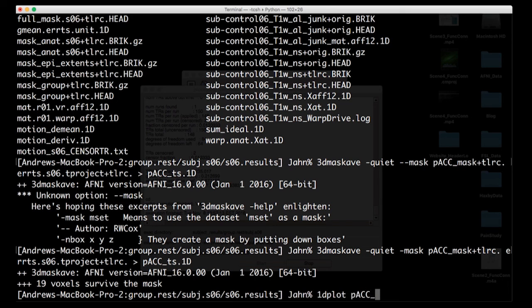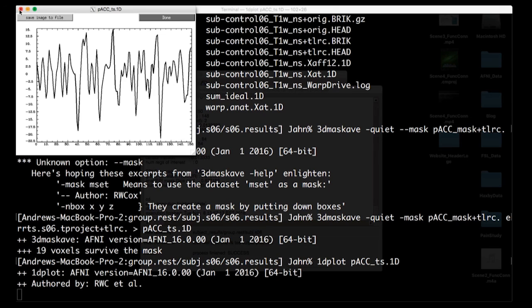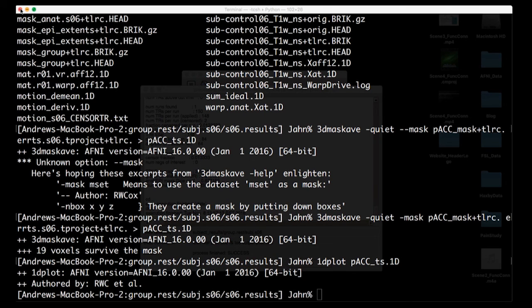All right, so again, double check, make sure that looks reasonable. So 1dplot, this is average across all the voxels in that mask for my error time series data set. So basically what we're going to do is look at this time series and try to match it up with every other time series in the brain and see what the correlation is like.